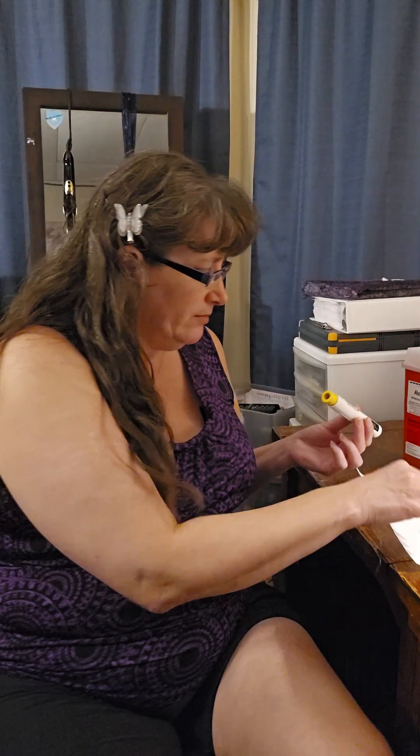It's really kind of puffy. In the future I really need to make sure I push it down all the way and keep it held all the way because it stings like a son of a bitch. At least it's not all over the floor.